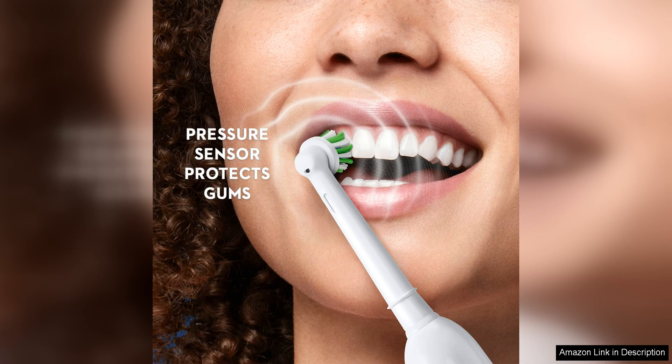The brush also has a built-in timer that ensures you are brushing for the recommended two minutes, with 30-second intervals to help you evenly brush each quadrant of your mouth.